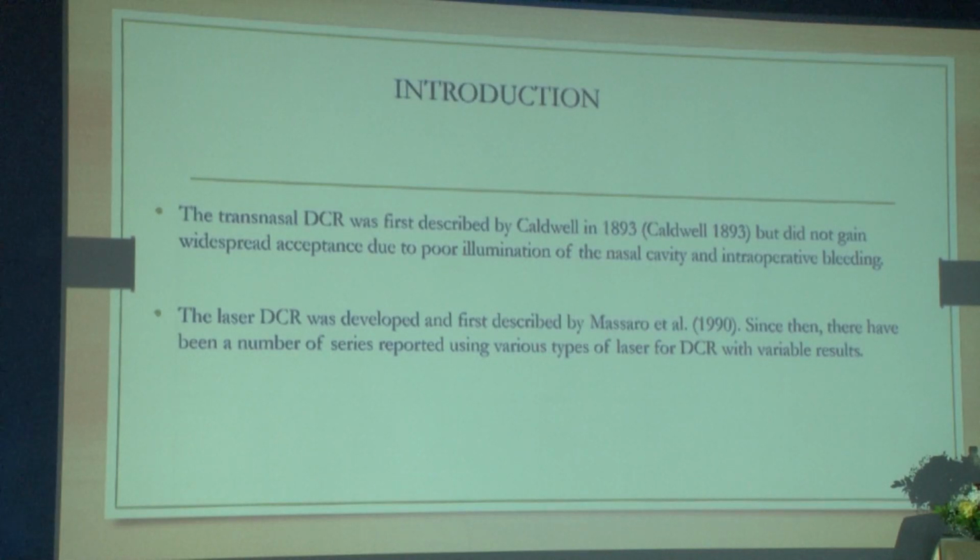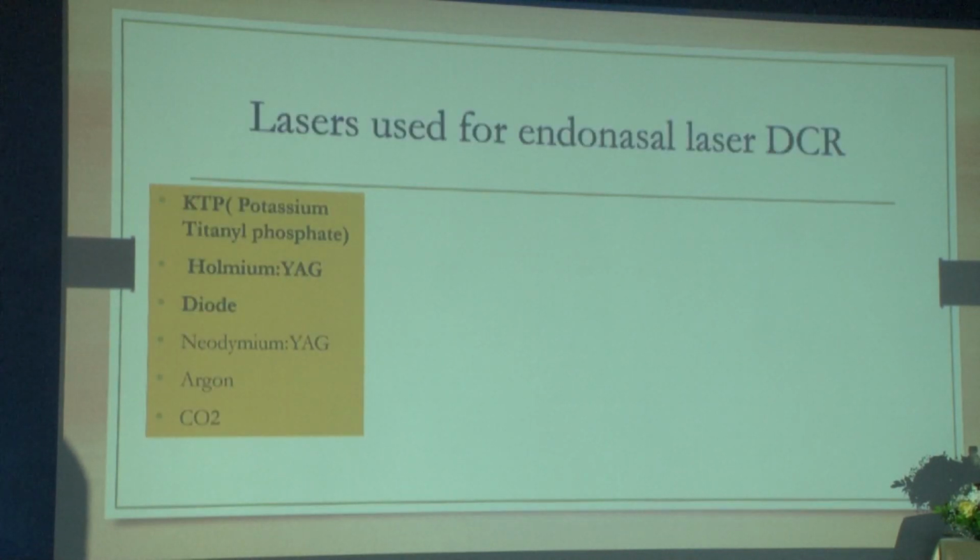Here I am going to discuss the lasers used in endonasal DCR. There are many lasers: potassium titanyl phosphate, Nd:YAG laser, diode laser, argon laser, and others, but the most commonly used are the KTP and diode lasers.